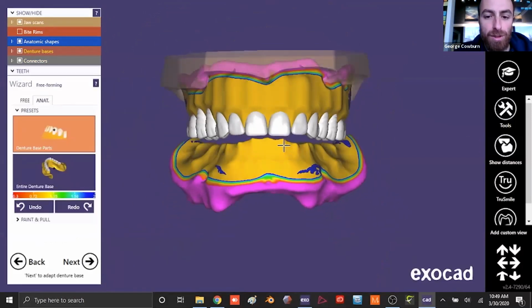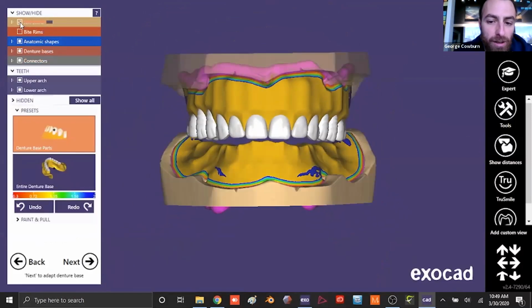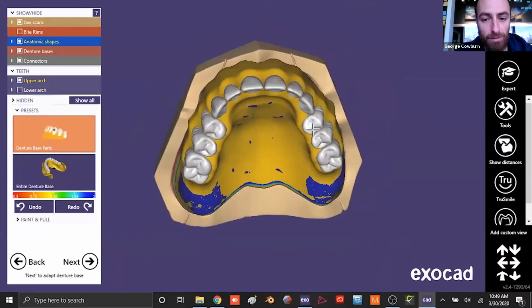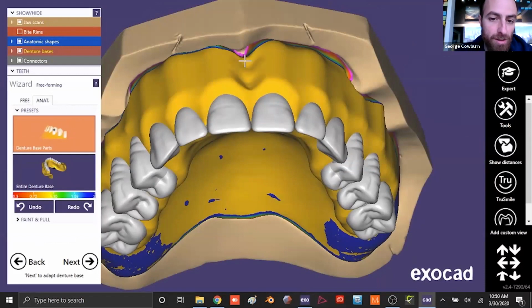Now this reduces a lot of the potential for error later on when we're seating these teeth in, like Adrienne's going to show later on tomorrow. So that if we have them all joined together, it's a lot more accurate.